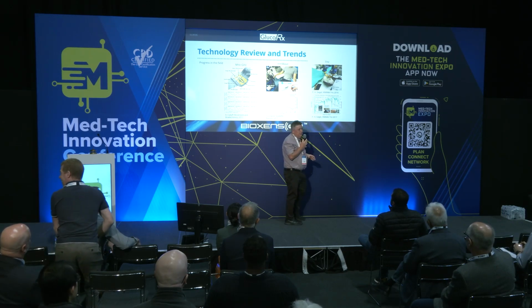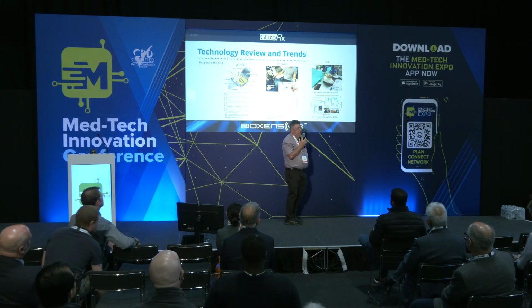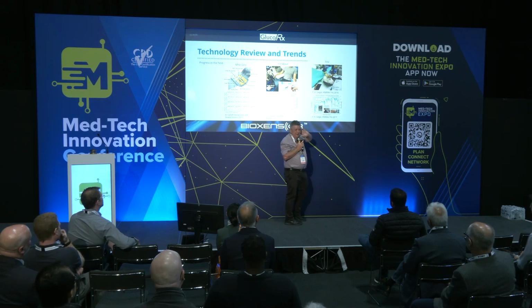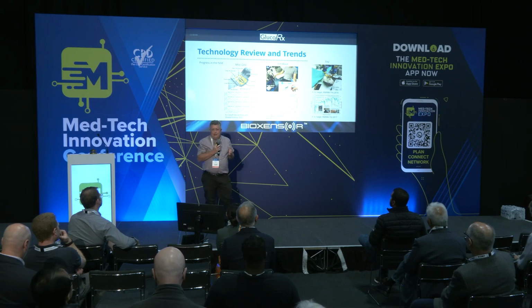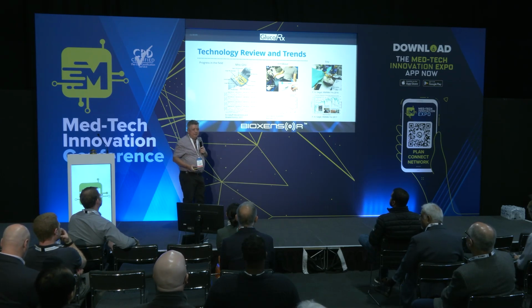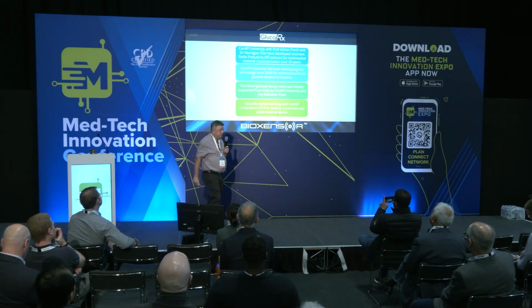You see a poor rat there who has a terahertz waveguide. You can see that the rat's ear is being interrogated with some terahertz signals. But again, there is a signature of blood glucose in the dielectric properties that are measured in all of these different types of sensors, you see. So this is our pathway.